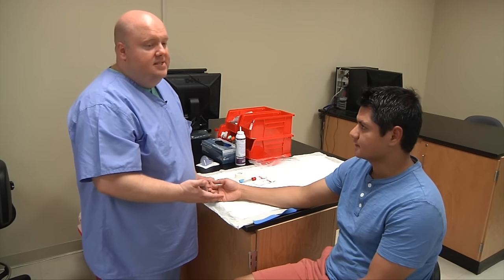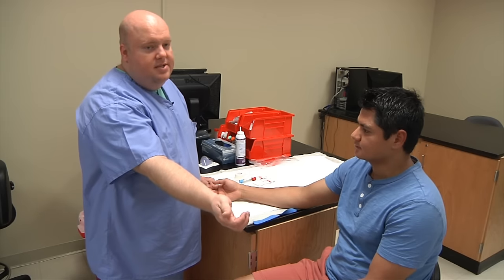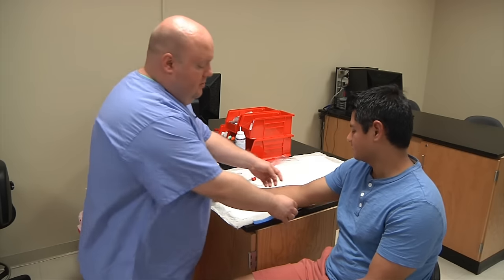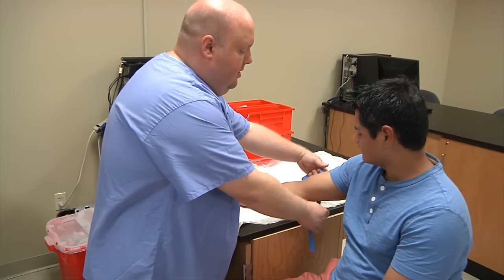With implied consent, this is where a patient makes a gesture such as sticking out their arm or shaking their head to indicate they don't mind. So I have my consent and we'll go ahead and begin the procedure.